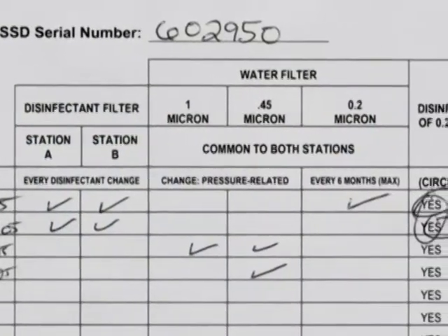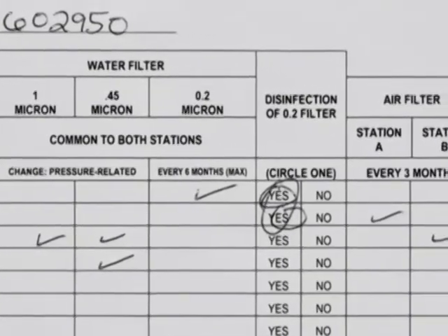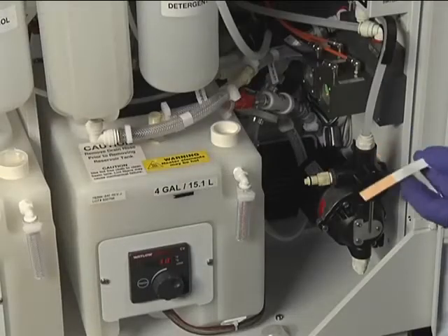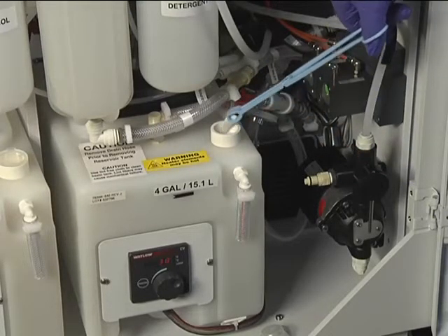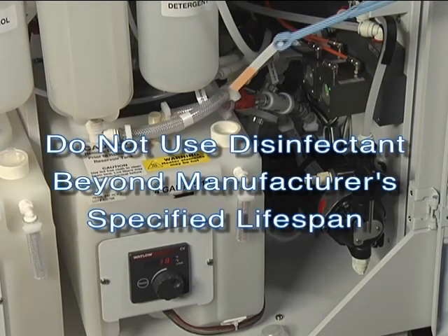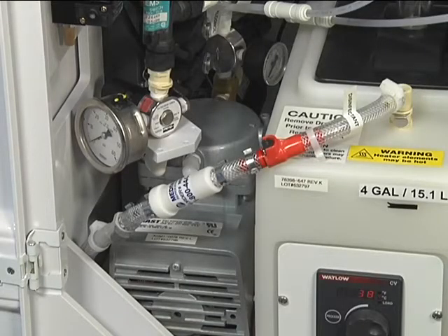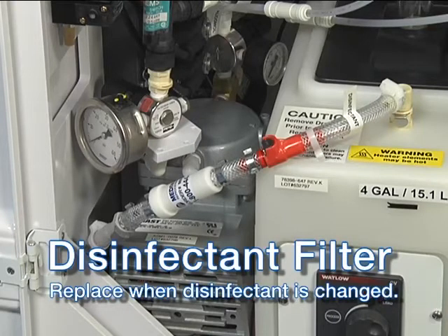Check when the disinfectant and related filters were last changed. If the disinfectant is within its usable lifespan, test it to ensure it is at least at the minimum effective concentration specified in the directions for use of the disinfectant. Regardless of the results of the MEC check, the disinfectant must be discarded once it has passed the lifespan indicated in the manufacturer's directions for use. Disinfectant filters should be replaced with every disinfectant change.